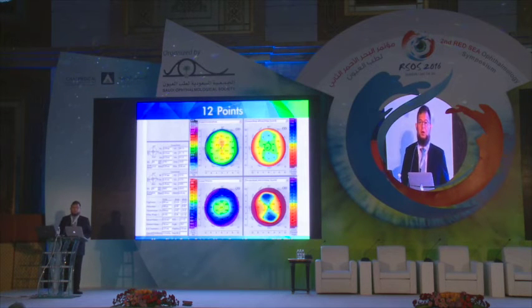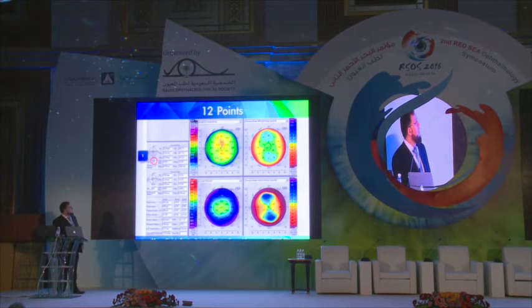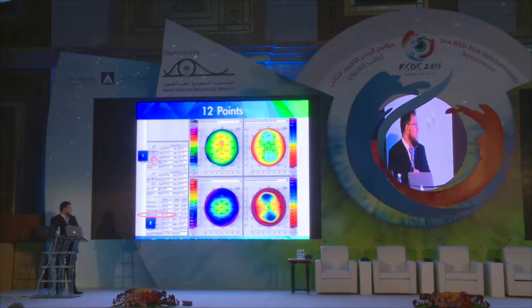So what are the 12 points that we should study? We should look at the quality specification, the quality of the picture. It should be okay in a white box. Then we look at the value of the Kmax, maximum K reading, thickness at the thinnest location, the vertical coordinate of the thinnest location, the topographic astigmatism, and the Q value.